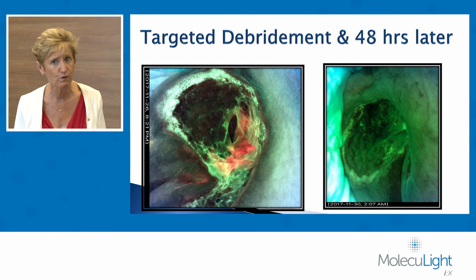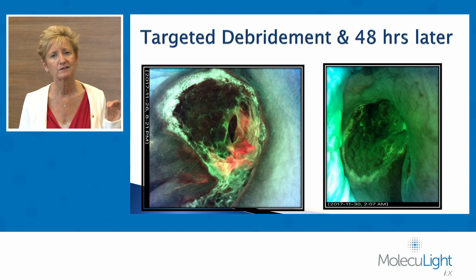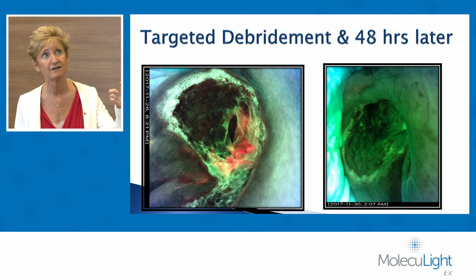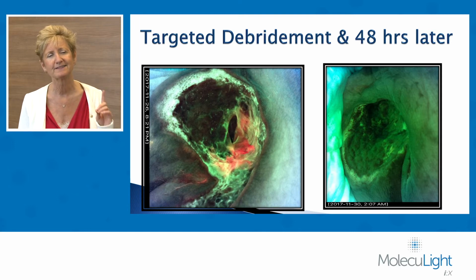In other words, 10 to the 4 or greater. And so again, this targeted our debridement. And so we removed all the areas where there was the red fluorescing, and then we re-imaged. Interestingly enough, 48 hours later, there was no reoccurrence. And that's where I found the MolecuLight very helpful.